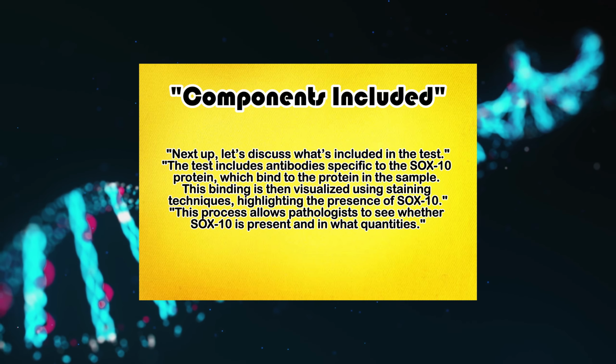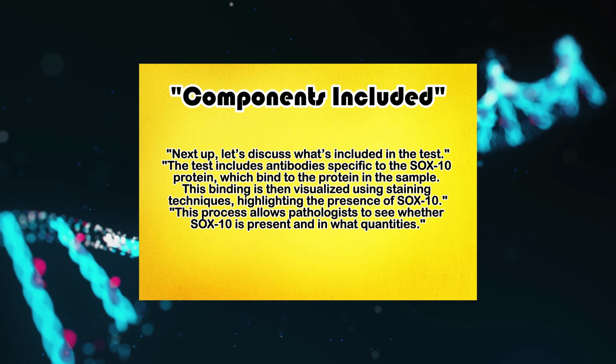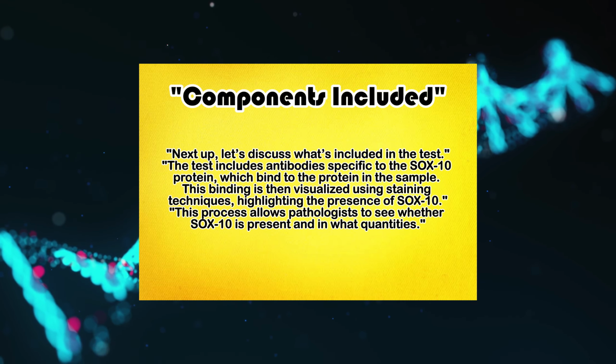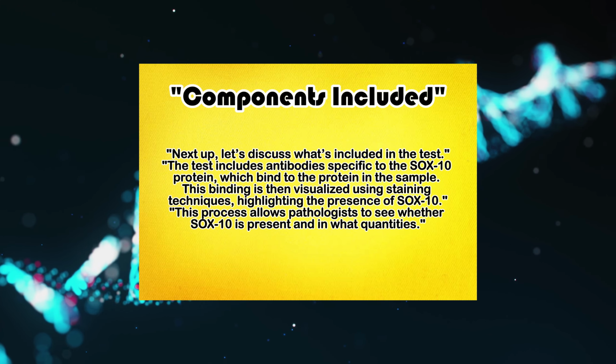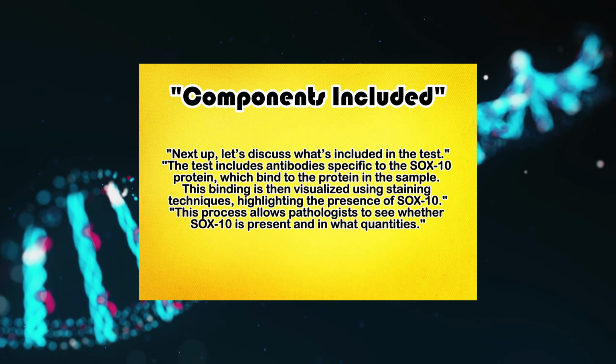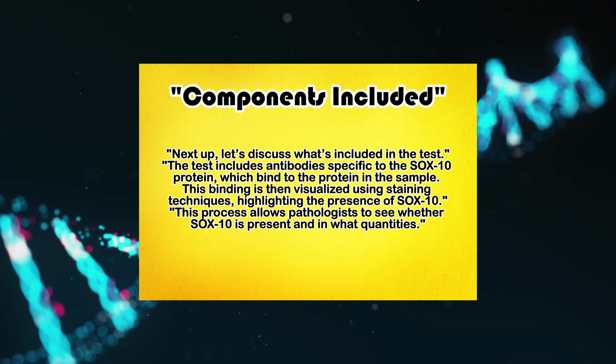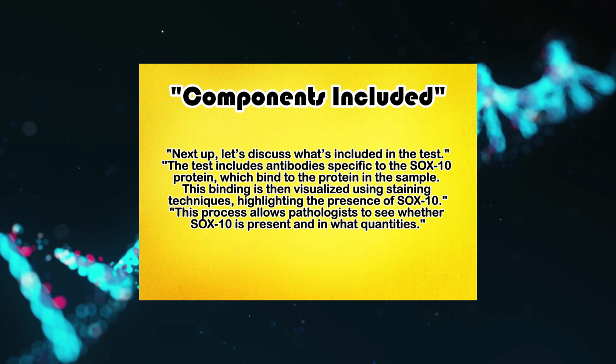The test includes antibodies specific to the SOX-10 protein, which bind to the protein in the sample. This binding is then visualized using staining techniques, highlighting the presence of SOX-10. This process allows pathologists to see whether SOX-10 is present and in what quantities.